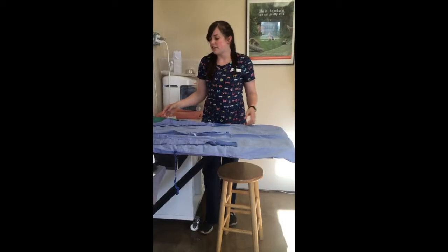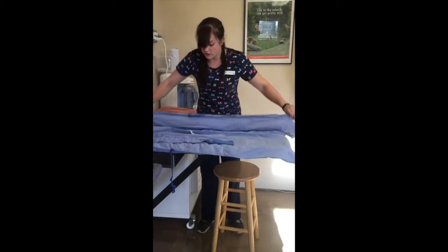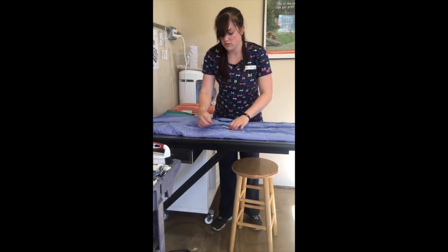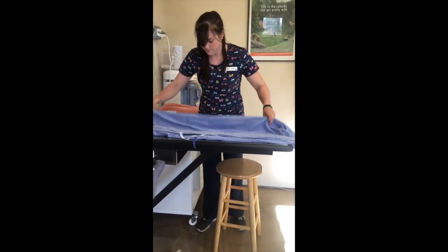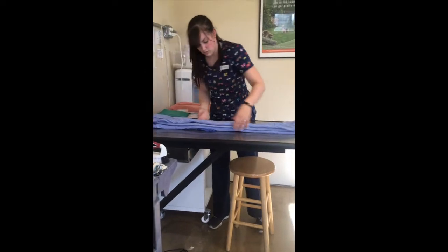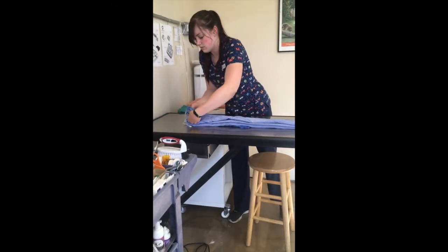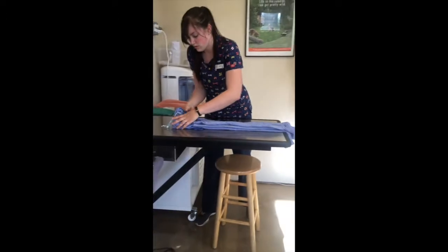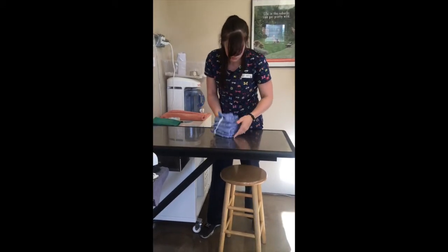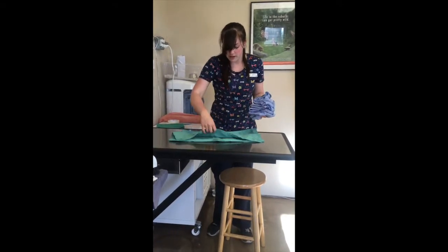I'm going to be demonstrating how to properly wrap a surgical gown. So I have my gown laid out here. I'm going to start folding it. And I want to fold it so that when the doctor opens it, it'll be nice and ready for them to put directly on. Go ahead and use my outer wraps, and I'm going to open them up.